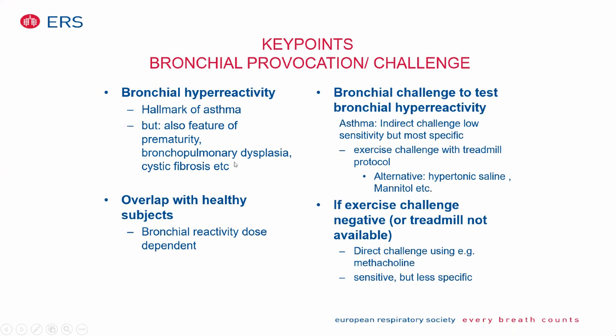So just a short summary of the bronchial provocation challenge. I think my time is over. Bronchial hyperreactivity is a hallmark of asthma, but is also present in many other respiratory diseases, and there is an overlap with healthy subjects. So similar to the bronchodilator test, it's only a piece of the puzzle and has to be interpreted with other clinical and physiological markers. A bronchial challenge test allows you to assess the degree of bronchial hyperreactivity.